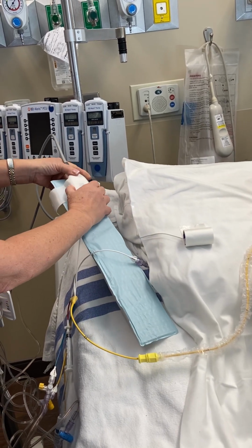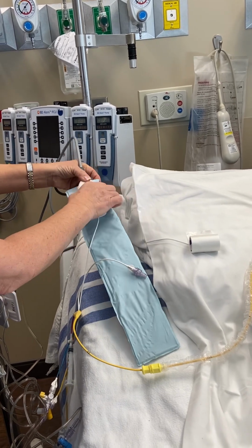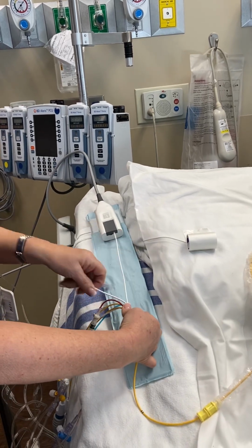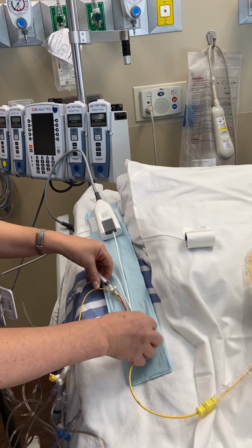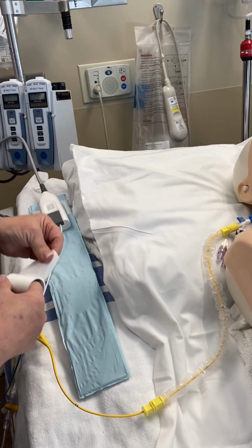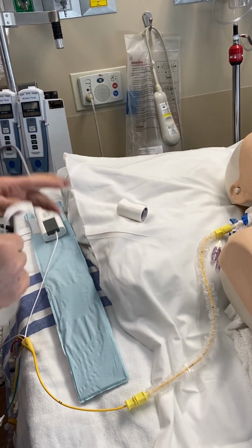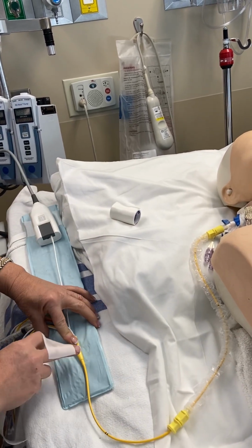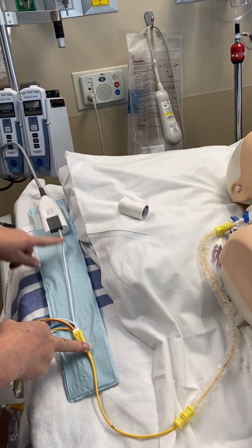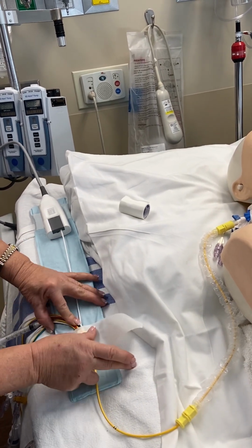So you have your silk tape, so you kind of make a little barrier around your op mod and then tape it around the side, and kind of pinch the sides so it holds it in place. So you should have 3 pieces of tape once you are getting ready to tape your Swan, okay? So I start with the top first, and then I use my next one. You need about 10 or 12 inches of tape, and you tape the bottom, because the biggest goal that you want to make sure you maintain is that this cord, this op mod, is straight on your board, okay, for accurate numbers.